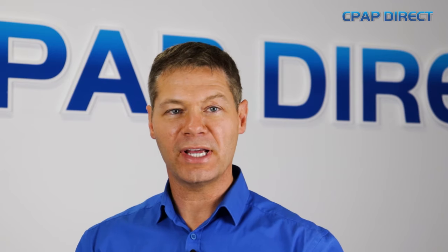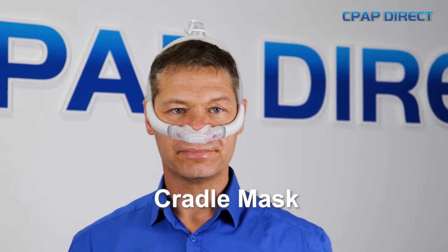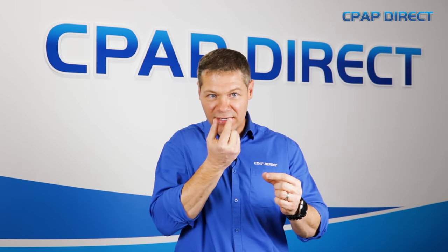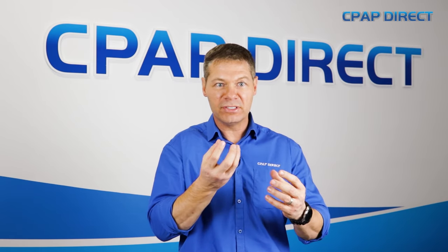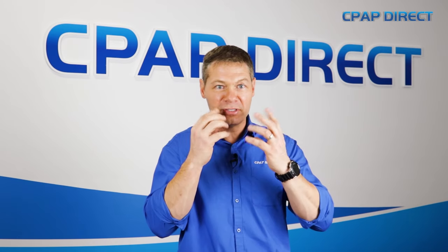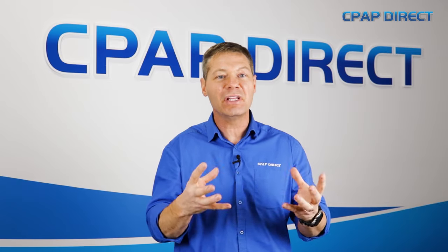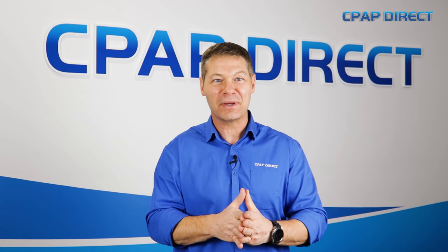The third style of nasal mask is called a cradle mask, and this is really a hybrid — a mix between a pillow mask and a nasal mask. It looks like a pillow mask but there are no pillows; there's a little hole in the cushion and it sits underneath the nose. They're also known as a UTN mask, or under-the-nose mask. They sit under the nose, don't give you any sores over the bridge of the nose, and are a great option for people that want that minimalistic feel of a pillow mask but don't want anything inside their nostrils.